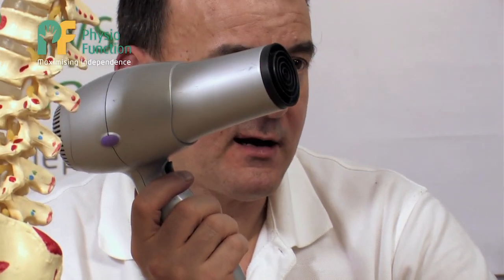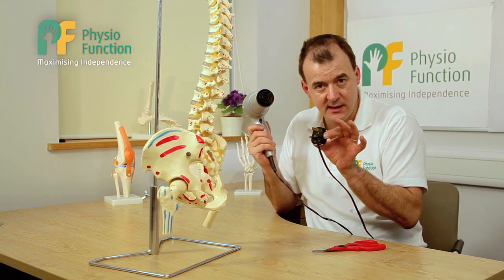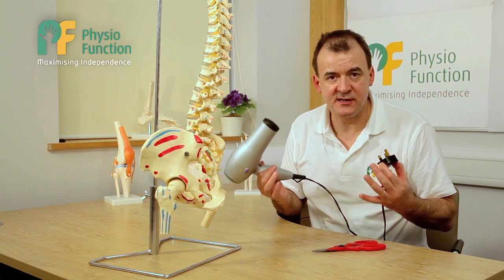If there's a power cut, I can take my peripheral device, go to my neighbor without the power cut and plug it in, and the device will still work. And that's what FES is — it's an alternative power source.